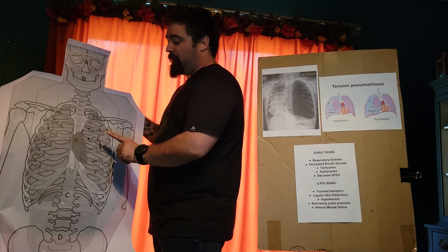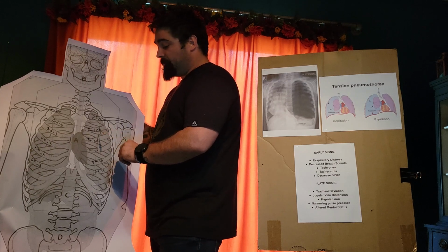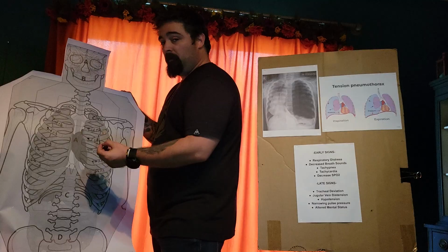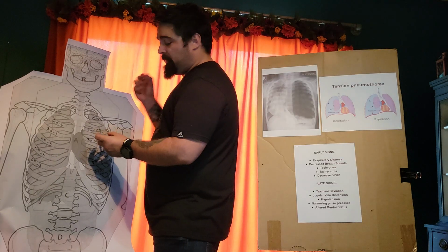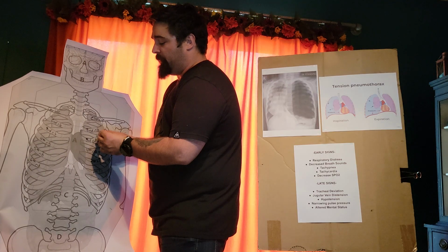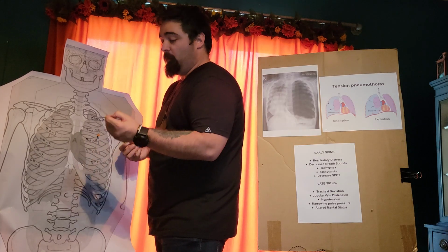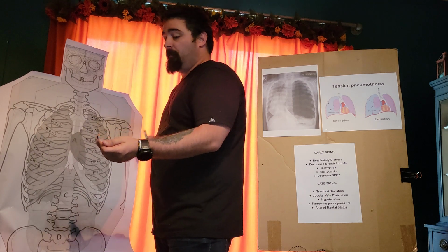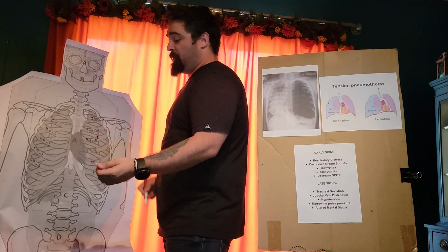Also, you can view the catheter. There may be fogging or misting or some blood return at the hub of the catheter when you've entered into the pleural space. So once you've advanced the needle, you've entered the pleural space, you have those indications. You're going to secure the needle, stop advancing the needle, and then you will advance the hub, advance the catheter down till the hub touches the chest wall, and then you will remove and you will properly dispose of the needle. You can use the tube that they come in. If you have this type of NCD, it can be placed right back into the tube.